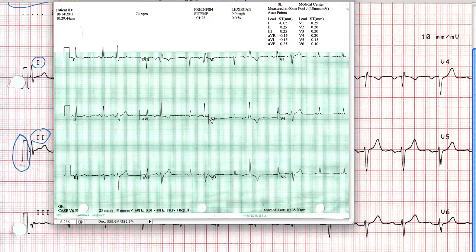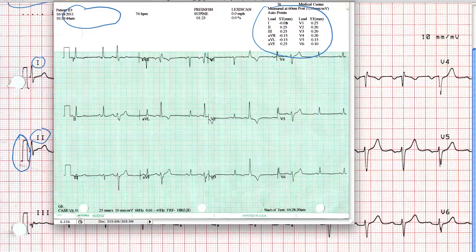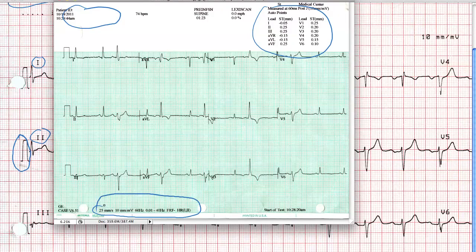Here's another example of an ECG done on a different manufacturer's machine, but it's basically got the same information. You've got patient ID over here, measurements of one kind or another — this happens to be ST segment measurements because this came off of a stress test machine. And at the bottom, you have information about standardization in terms of paper speed and calibration size.